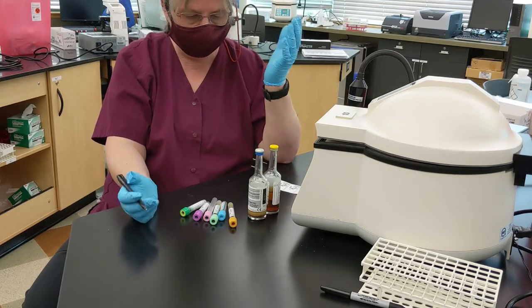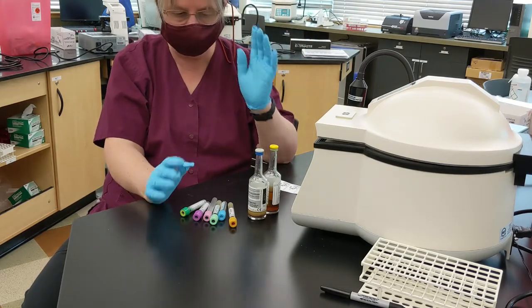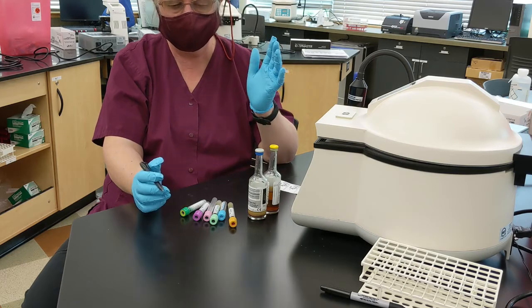When you're doing phlebotomy, order of draw and labeling of your tubes is really important.